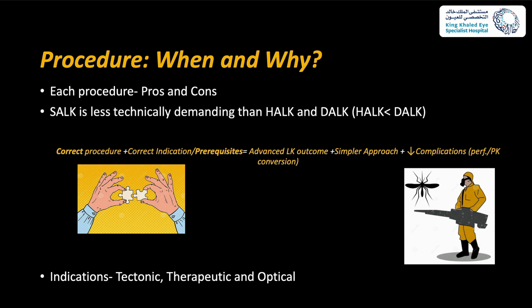SALK is technically less demanding compared to HALK, and HALK is less demanding compared to DALK. Utilizing the correct procedure for the correct indication, and the prerequisites for the procedure itself, will give you the advanced lamellar keratoplasty outcome, and the standard is DALK, with a simpler approach and fewer complications, mainly perforation and PK conversion. When you look at a disease that can be treated with superficial anterior lamellar keratoplasty and you do DALK for that, it's like killing a mosquito with a machine gun.